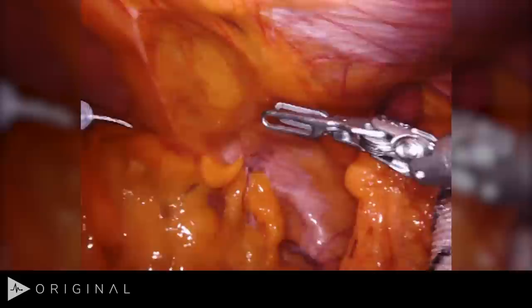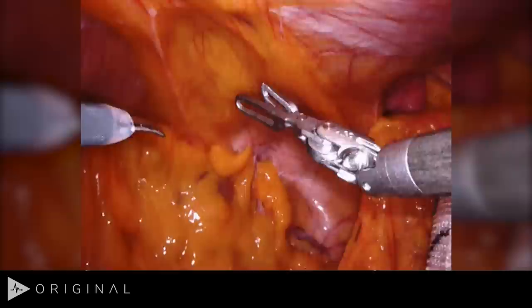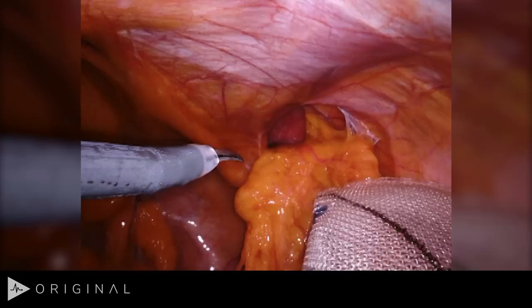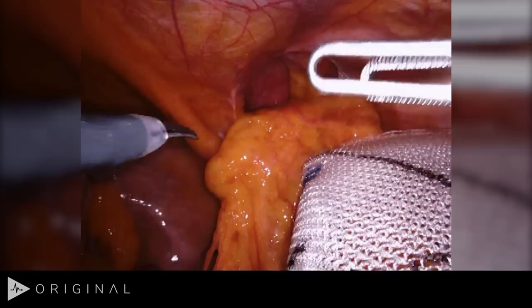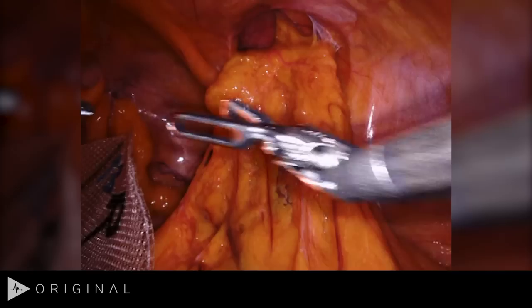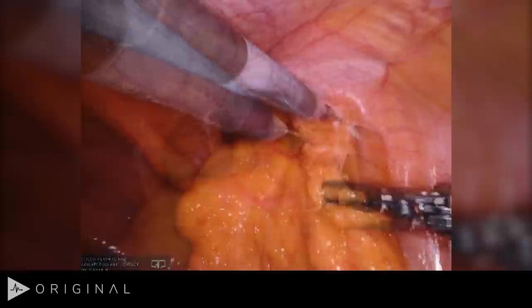Here's the dome of the bladder. You can see the medial umbilical ligaments here — that's the obliterated. I like to look and see where the inferior epigastric is laterally. This is a large indirect hernia, which makes things a bit harder — the indirects are more challenging than directs robotically. Here's our mesh; we'll set it aside. The patient has just a little tongue of omentum, so I'm going to take that down because it'll weigh on the peritoneum, and at the end of the case we'll want to tack the peritoneum back up.